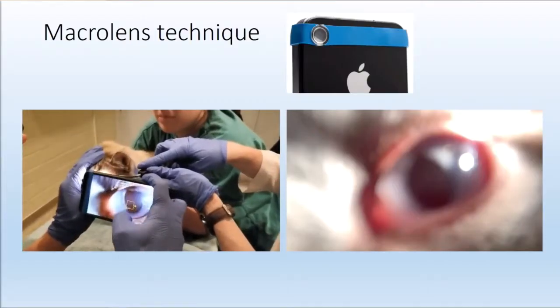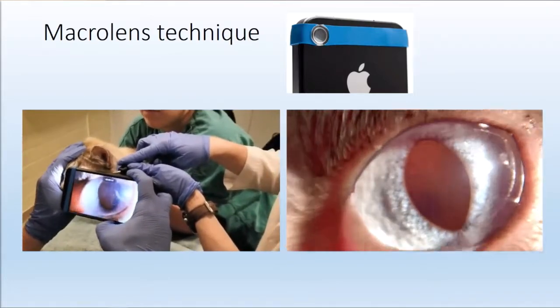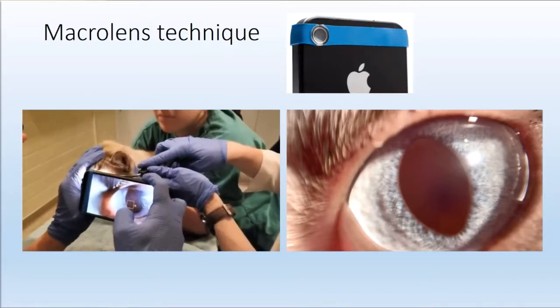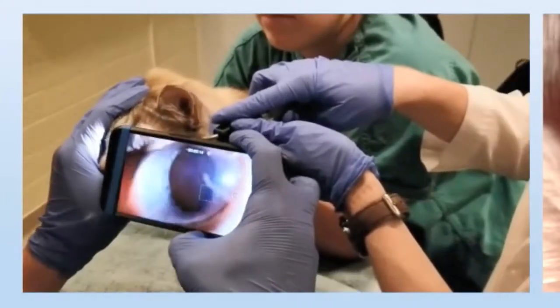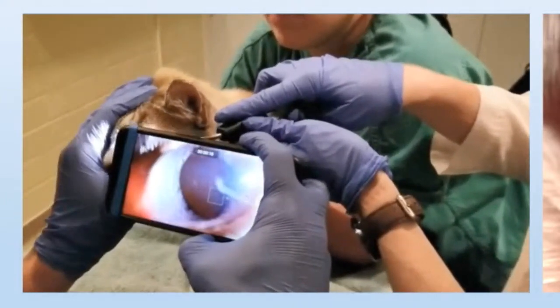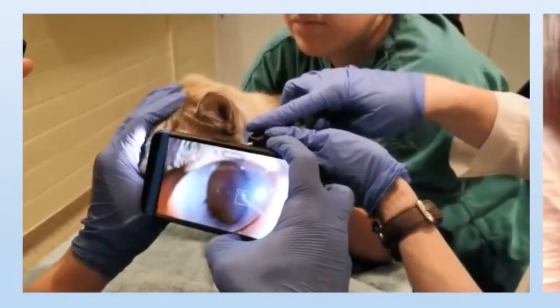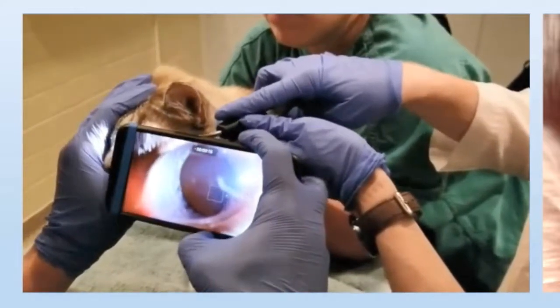So this is my own cat, just showing you side-by-side videos of what the image acquisition looks like and the image that we are actually producing. You see my thumb is tapping on there's a hair on the cat's cornea here. My thumb is often tapping there to refocus because it'll pick distant objects and you'll see things out of focus.